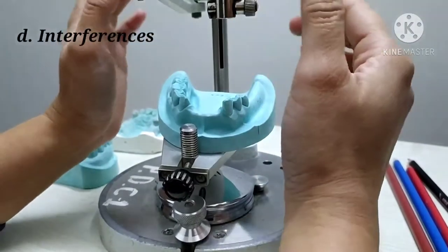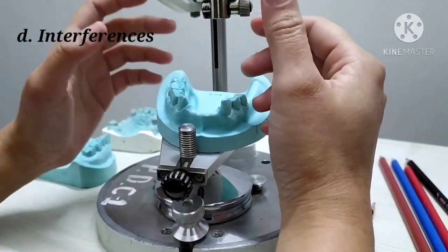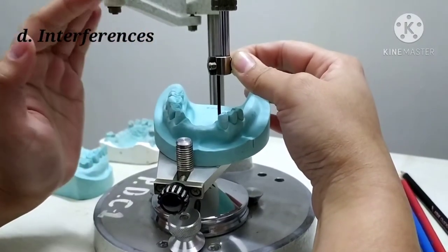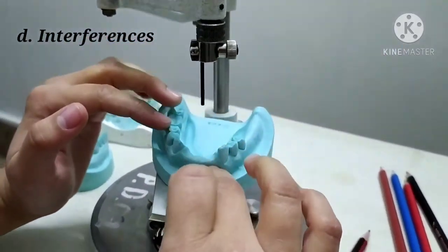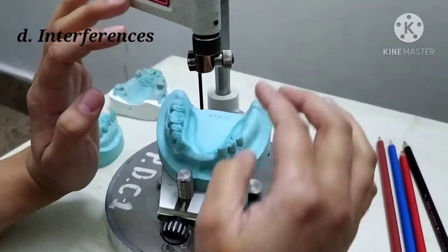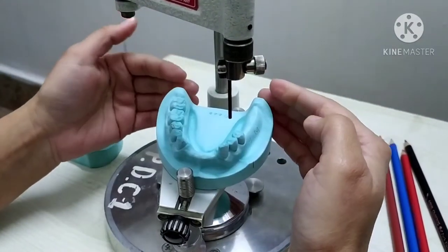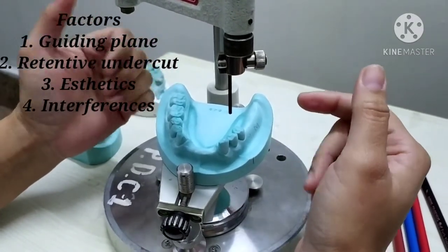The fourth factor is interferences. In the maxillary arch there can be several interferences such as palatal tori or bony prominences. In the mandibular arch, lingual tori in the premolar region, bony prominences over the labial portions, or lingually or buccally inclined teeth must be properly evaluated, and the desired tilt must be determined to avoid them. This covers the determination of the path of placement and removal, considering all four factors: guiding plane, retentive undercut, aesthetics, and interferences.